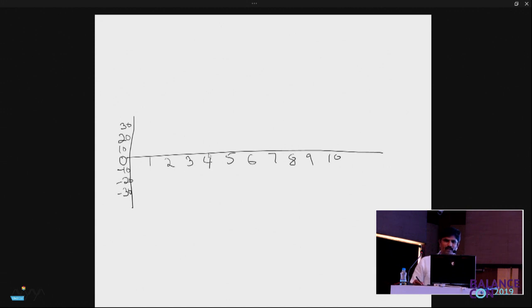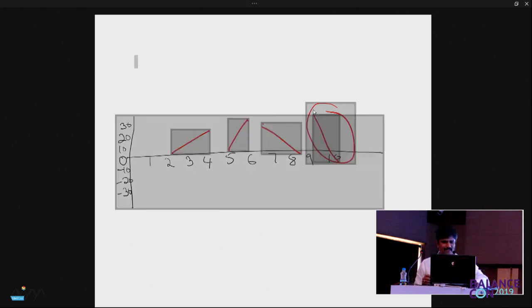Now, if I write two lines, this one and this one, which is faster? The second one is faster, the first one was slower. Both of them represent that the eye is moving to the right side. Now, this versus this, which side is the eye moving in these two? Left side. Which is faster? The last one, correct? So this is the faster movement. Now let us go into the details.